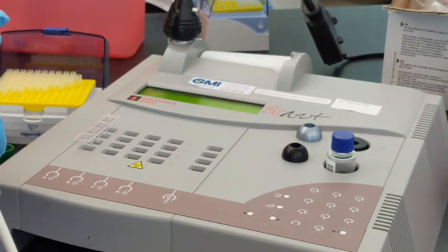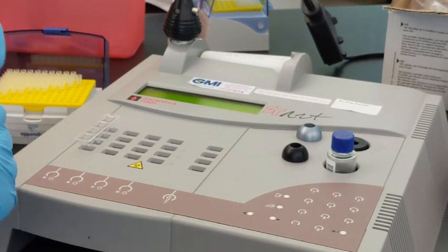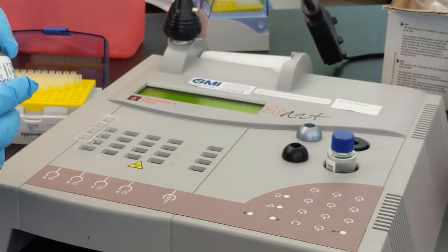And then hit the timer so that the timer will go, in this instance, for 180 seconds. And that will ensure that there's been enough time for the patient sample or QC to interact with this reagent and to get up to 37 degrees.